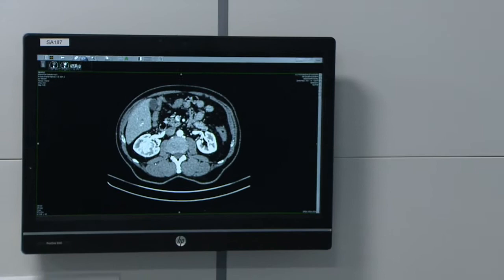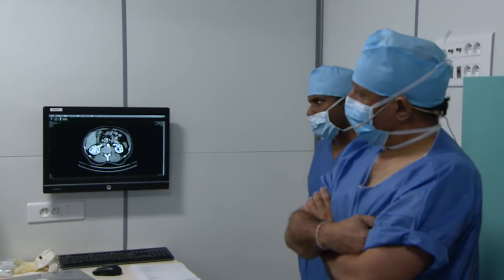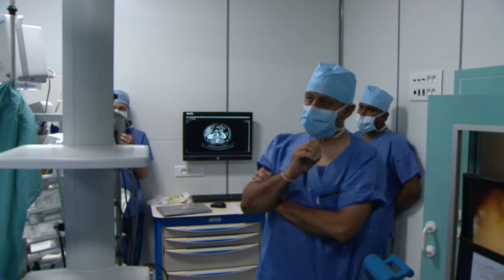It's very challenging. I would like to know which is your plan of attack. Are you going through the hilum, or are you going to the point where the kidney is near the surface? So our plan is going to be, we are going to go transperitoneally, and we have the SI robot docked, and we have two assistant ports.